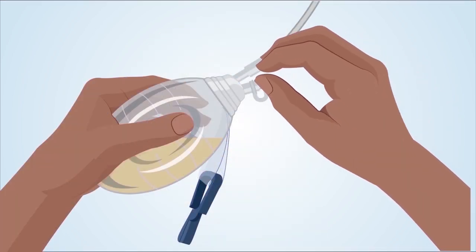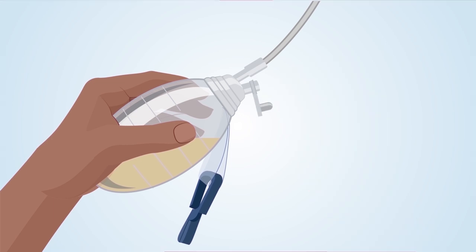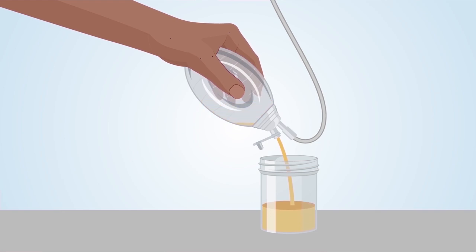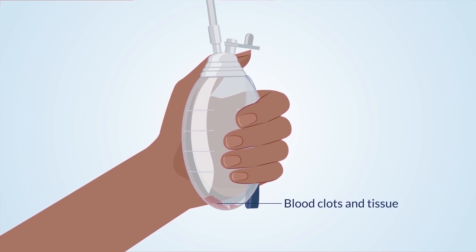Step 1: Unplug the stopper on top of the bulb. The bulb expands as it fills with fluid — you may notice that the bulb expands further when the stopper is removed. Do not touch the inside of the stopper or the opening of the bulb, to reduce the risk of infection. Step 2: Turn the bulb upside down over the measuring cup and gently squeeze it. The fluid from the bulb will drain into the measuring cup. Step 3: Once the bulb is drained of fluid, turn the bulb right side up. There may be blood clots or bits of body tissue at the bottom of the bulb — this is normal and will not harm you. Do not wash or rinse the bulb with water, as this can lead to infection.